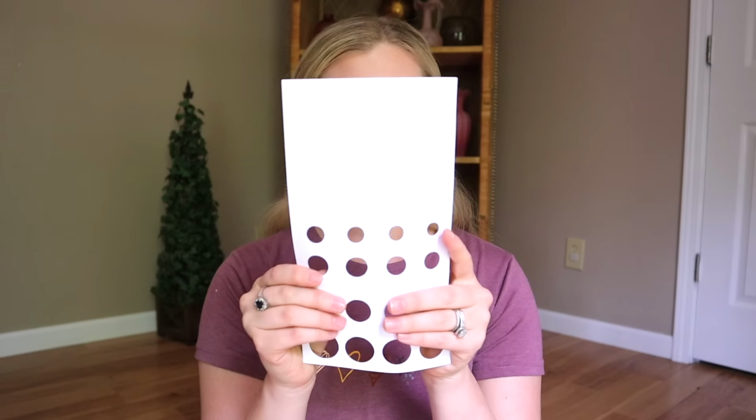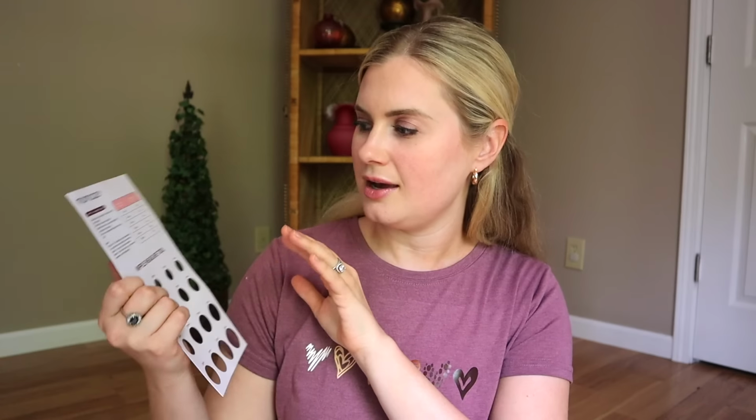Here's a little tip sheet. These are super helpful to have. Most women, I feel like, are probably going to use one of the inserts that come with it in order to get a really nice suction. So what you're going to want to do is stimulate your nipple. Breastfeeding moms' nipples are going to look a little different when they're stimulated versus when they're just resting. So maybe use a manual pump or hand express a little bit to make sure your nipple is stimulated, and then use this to figure out what insert you should be using.